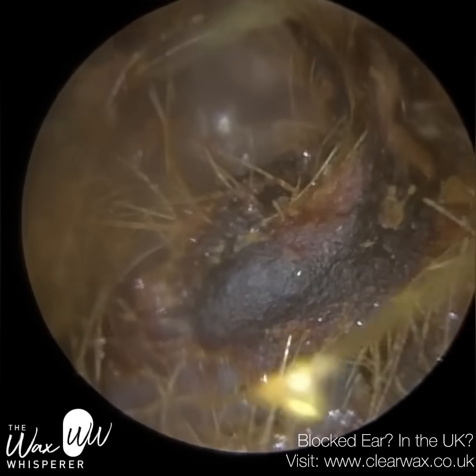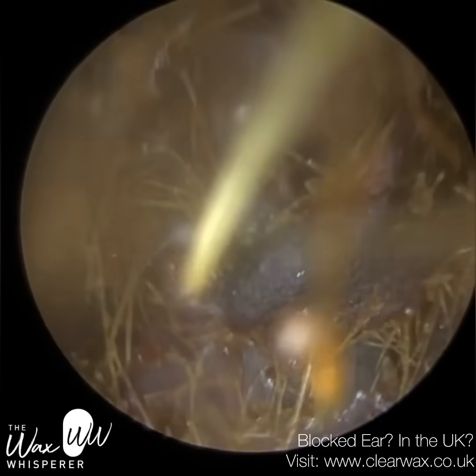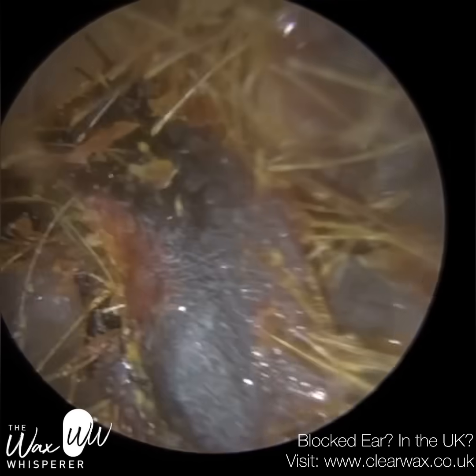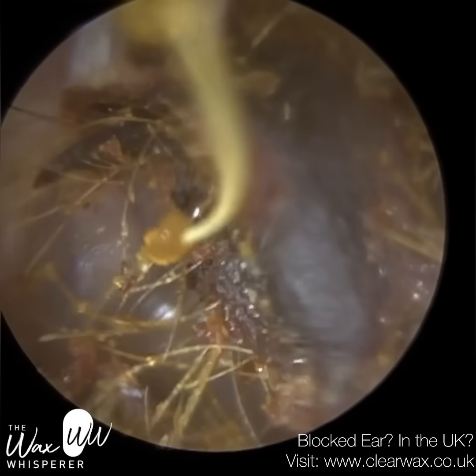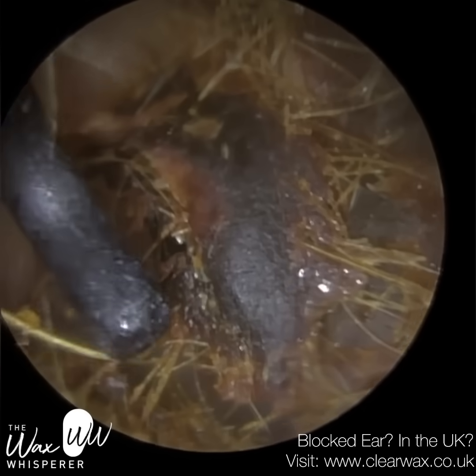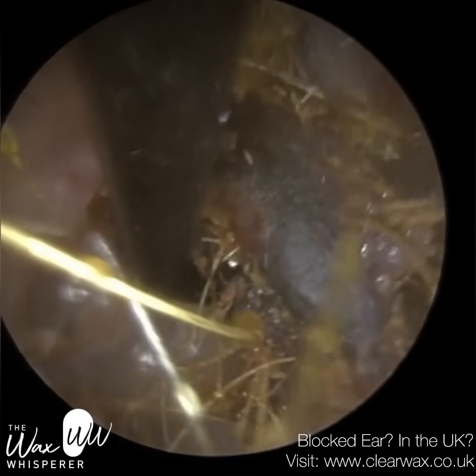We have here a patient who attended with a blocked right ear, and the wax is very dark, which tells us it's been there for a while, so it's aged, it's matured, it's oxidized. It's matted with hairs, which would also suggest the patient may be poking inside their ears.